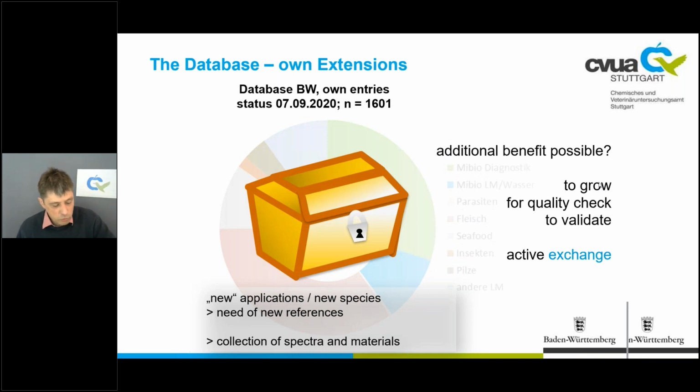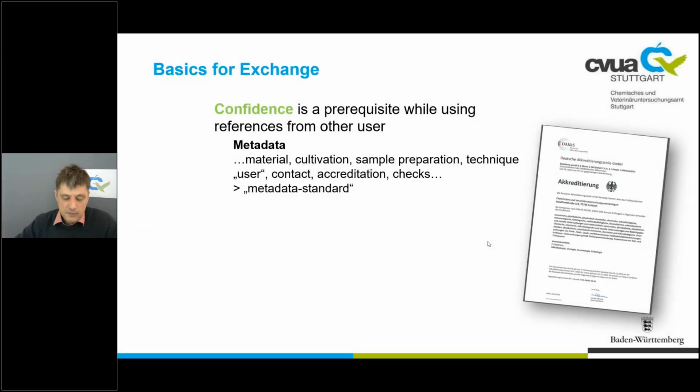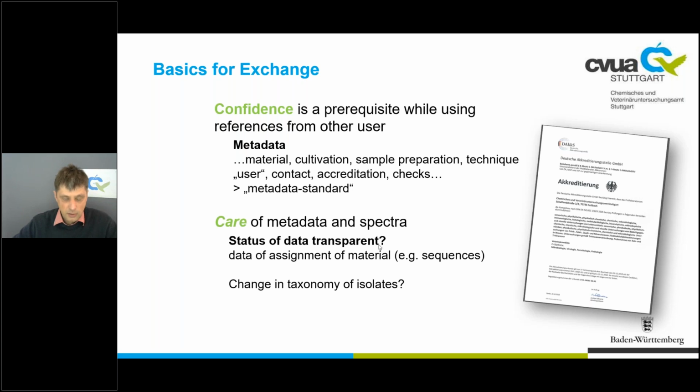To utilize this treasure of reference spectra more effectively, an exchange with others will be helpful. There are some basics for any exchange. You need confidence in the work of your colleagues. A consequent, transparent presentation of metadata helps here. And in the timeline, you have to take care of your data. It's really necessary to give a transparent status of the data.